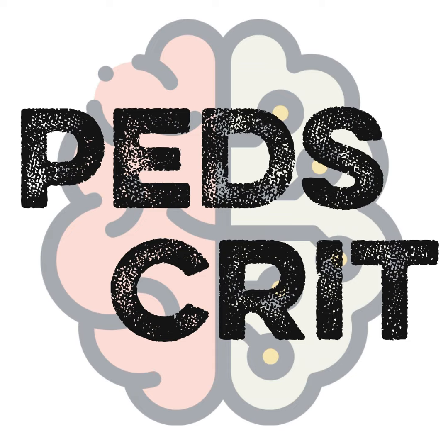The other nice purpose for them in ECMO is that when you have a patient who's cannulated through an artery that is perhaps important for blood flow to a limb, let's say femoral artery or axillary artery, you can put a NIRS on that limb and make sure they maintain adequate NIRS readings on that limb to make sure they're not getting ischemic. The other thing you could do is put a little cannula in there to return some blood flow distal to the cannula, but both would also be ideal. So we do use the NIRS in those patients.